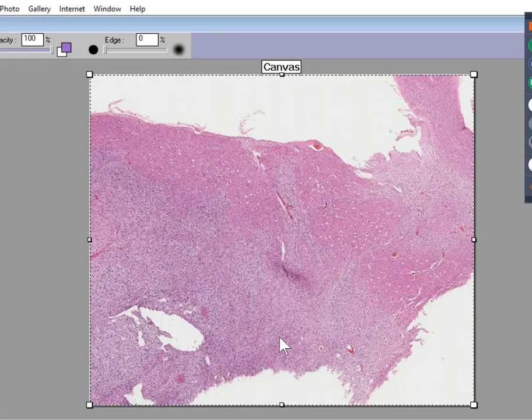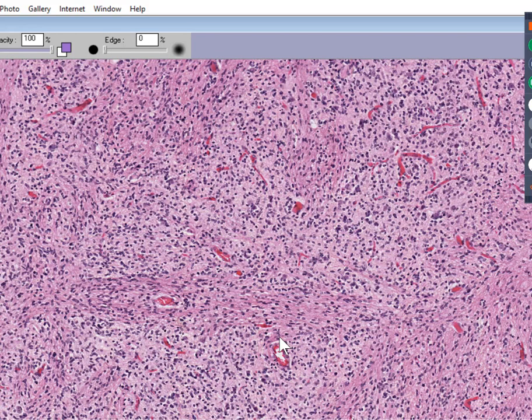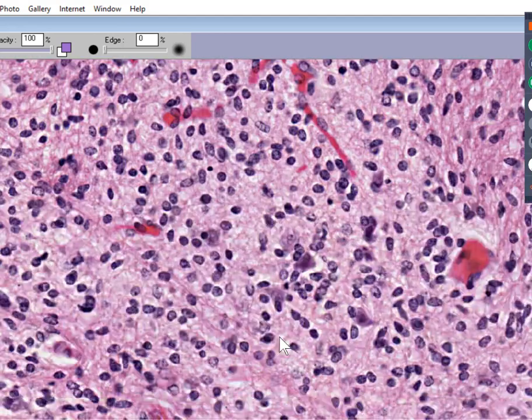And you can already see that it's largely not necrotic, but you can also see when you look closely at the cells of the primary brain tumor, these are not metastatic adenocarcinoma cells. This is not squamous cell. These are cells which kind of look like normal glial cells, except for one thing.